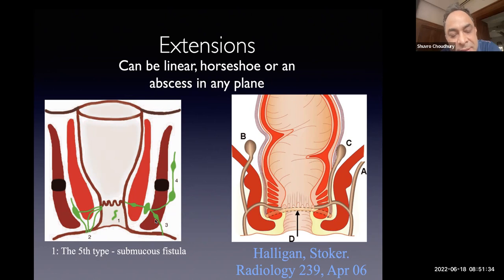So that is why I think surgeons and radiologists should work together. If this is done in an OT setting with good fluoroscopy, you know, in the old days when we used to do fistulograms, we used to see these tracts. So if you can see this tract, you can put a Terumo and a catheter and go with a sheath, and then you can put a laser, and then you can deal with it.